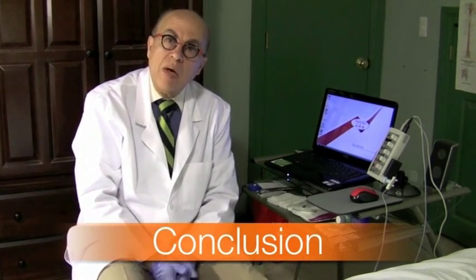All right, so now we're done with the upper and lower extremity nerve conduction studies. We used the routine sets of nerves that we do in the upper extremity and the lower extremity to explore the most common conditions that we encounter, namely carpal tunnel, upper extremity pain, ulnar neuropathy at the elbow, wrist drop, sometimes brachial plexus injury. In the lower extremity, more commonly than not, peripheral neuropathy, low back pain, and so forth. And you've seen the muscles.